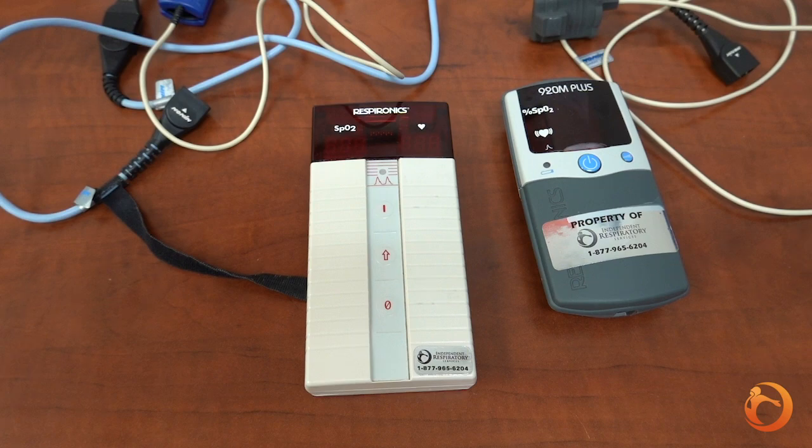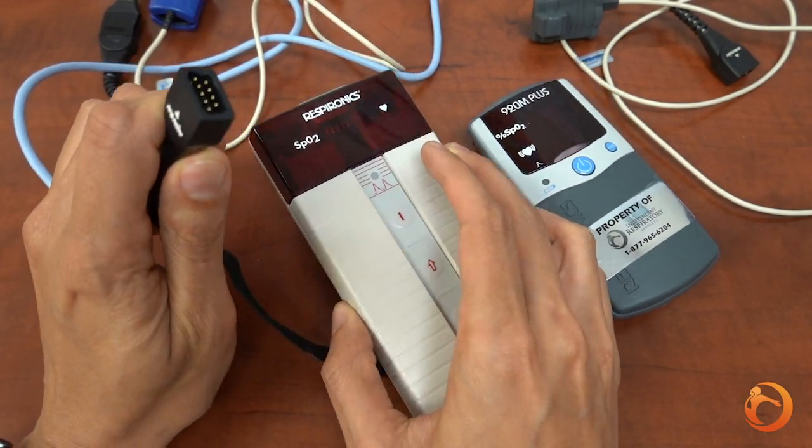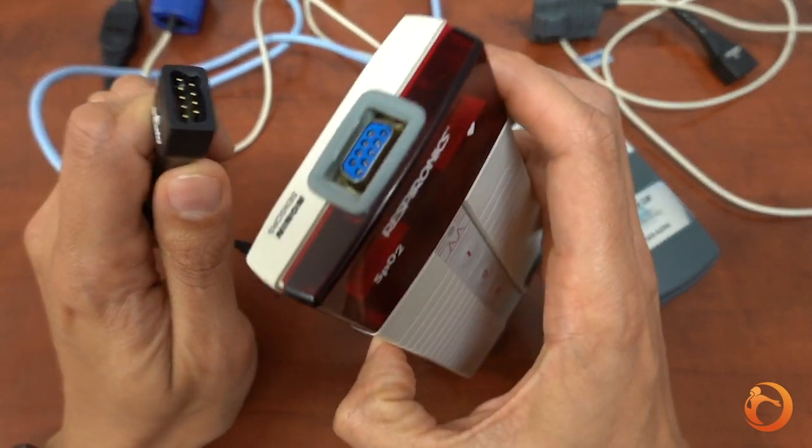Start by attaching the black end of the cable to the input of the device. The trapezoid shape will only fit in one way. Follow the pins.